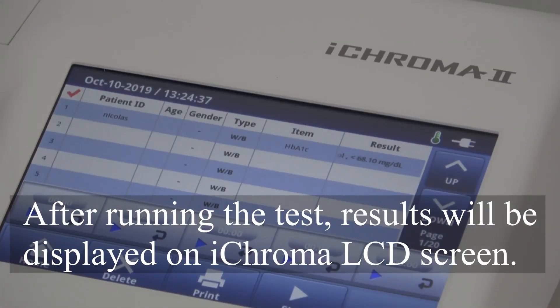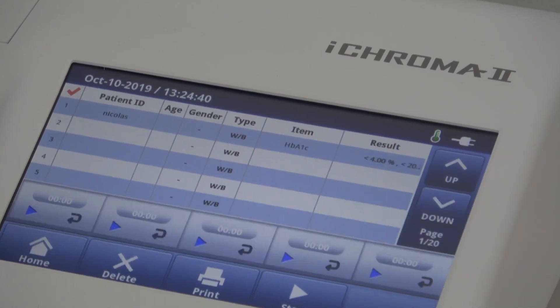After running the test, results will be displayed on the ICHROMA LCD screen.